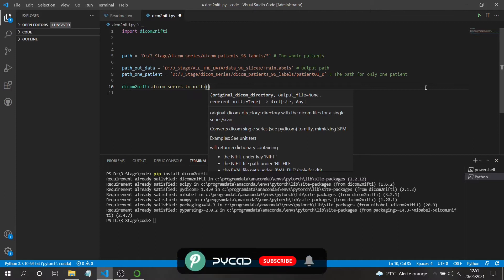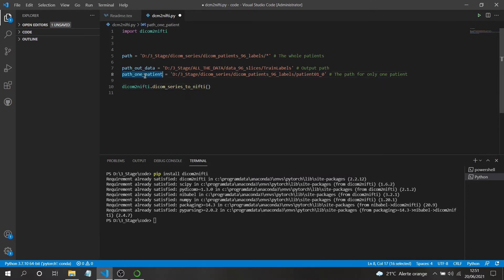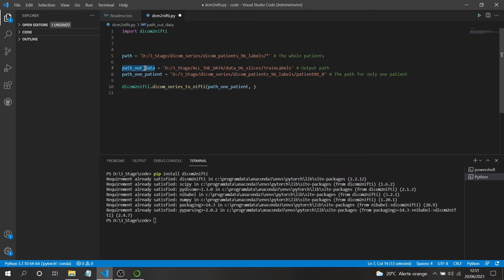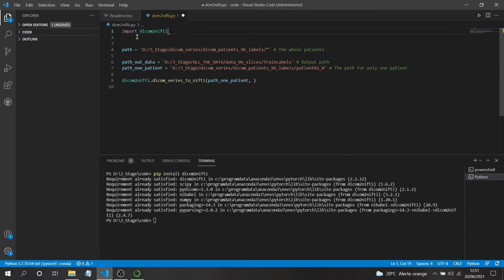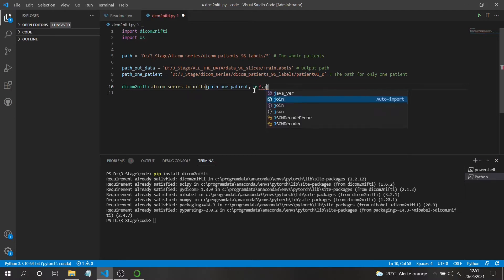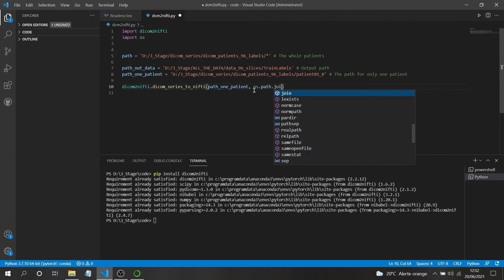The dicom_series_to_nifti function takes two parameters: the first is the input directory containing the DICOMs, and the second is the output path including the filename. We'll start with one patient, so we use the path for patient one. For the output I prefer to use the os library with os.path.join rather than concatenating strings directly.